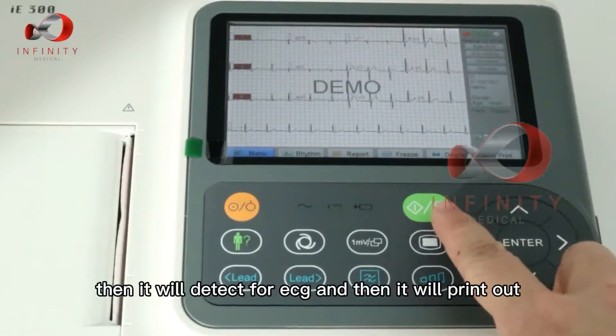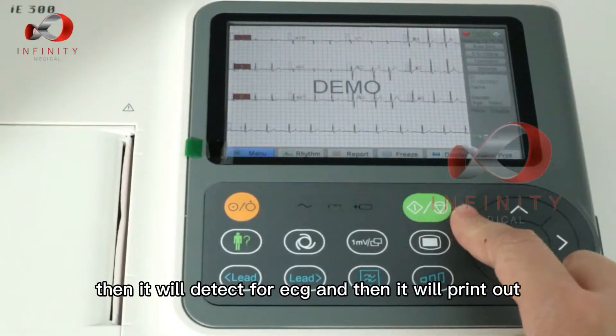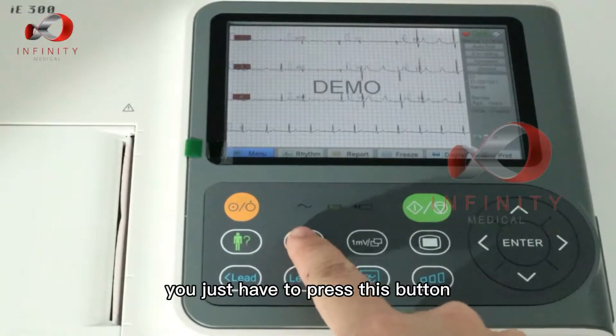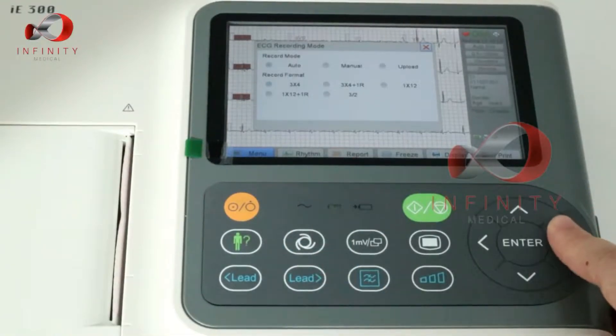This is in auto mode, so once you press it will detect for ECG and then print out. If you want to change it to manual mode, you just press this button.